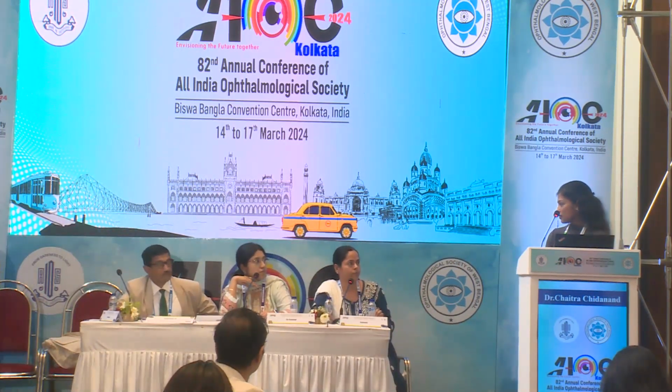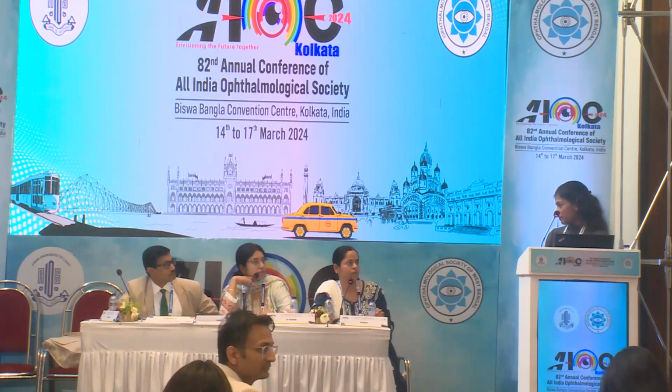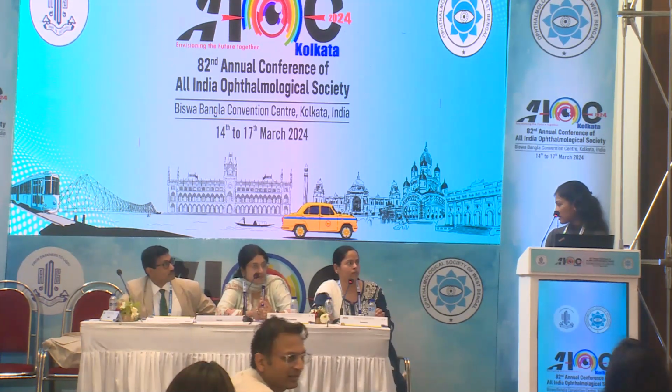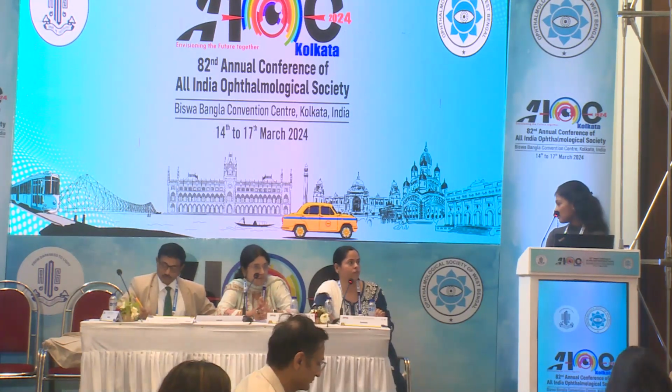Conjunctiva and the scar tissue were incised, ma'am, by horizontal incision, and the spherical implant was placed in the scleral bag. Also, the sclera was sutured, along with the conjunctiva. Then the buccal mucosal graft was harvested.